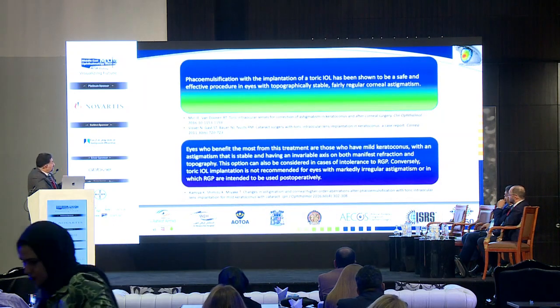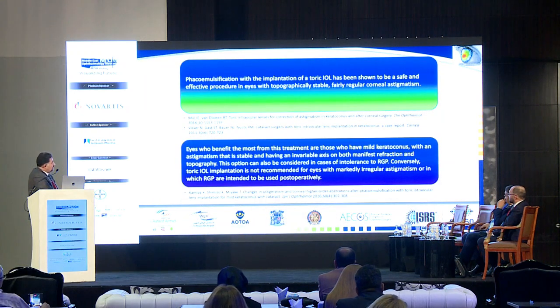So phacoemulsification with implantation of a toric IOL has been shown to be safe by this last publication, 2016, and there is also a benefit from this treatment, but it should be a regular astigmatism.